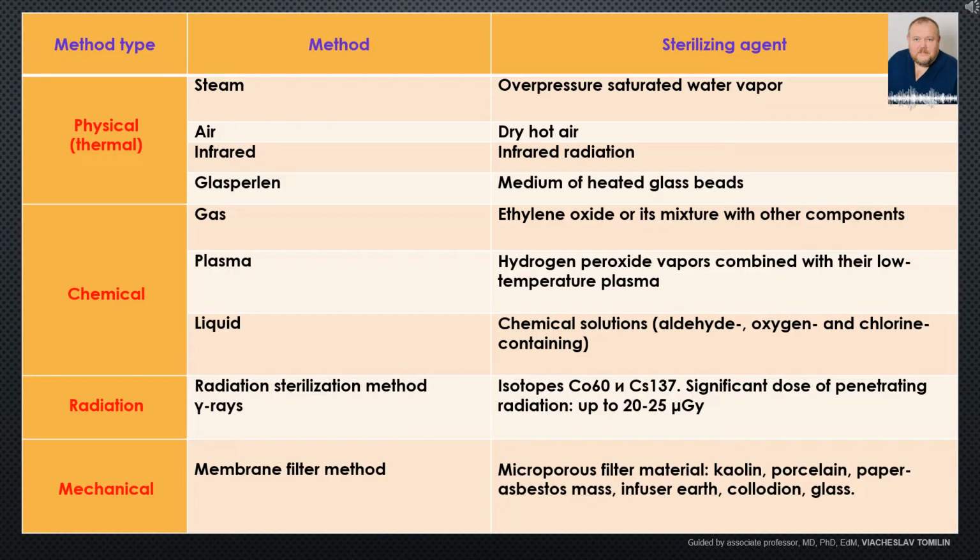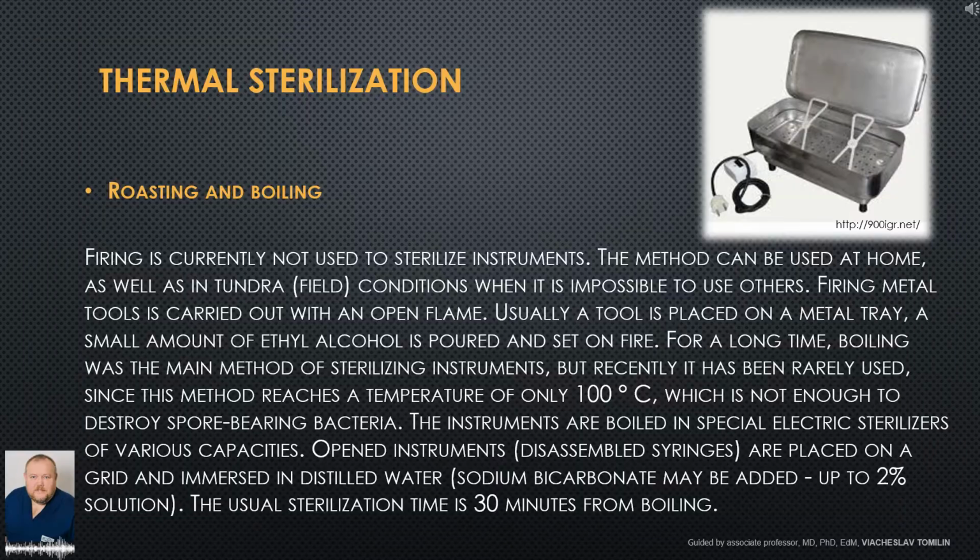Method type and method. Physical, thermal: steam, air, infrared, glass perlen. Chemical: gas, plasma, liquid. Radiation: the radiation sterilization method uses gamma rays. Mechanical: membrane filter method. And sterilizing agent. These are presented on the current slide.